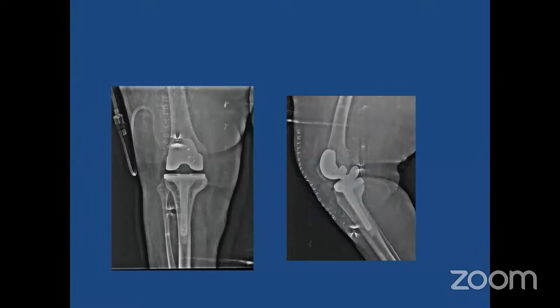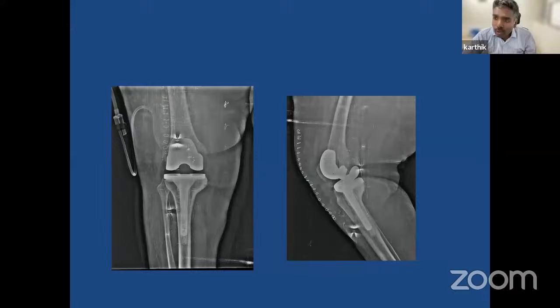Next case, Kowshik? Anything to add? Are there any questions from other participants? So, Karthik, in this case, did you plan a deep dish initially and adjust the slope for PCL resection, or did you decide otherwise? I go for deep dish most of the time.